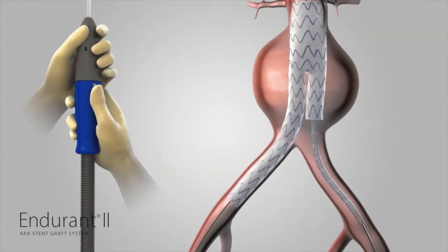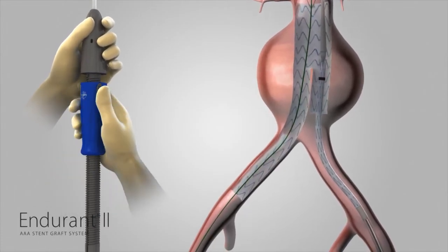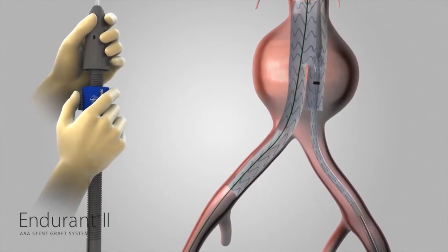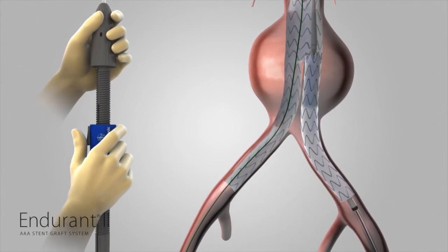Hold the front grip of the delivery system stationary. Then slowly withdraw the graft cover with the other hand by rotating the slider counterclockwise. At any point, use your thumb to pull the trigger on the slider and pull the slider back all the way to finish deploying the stent graft.